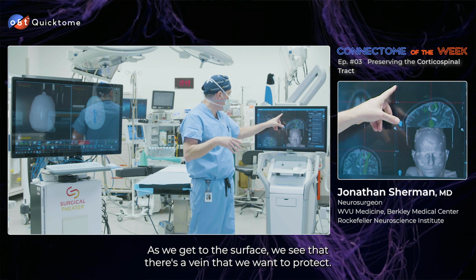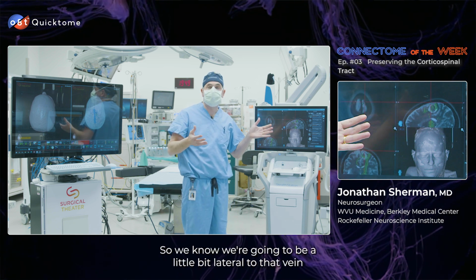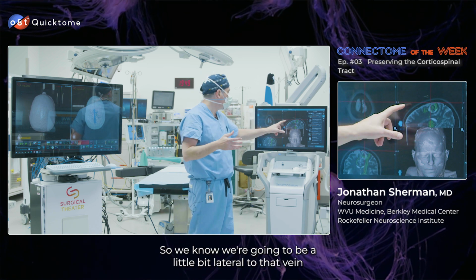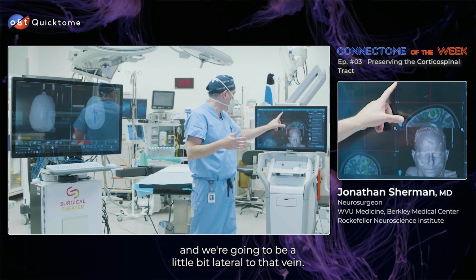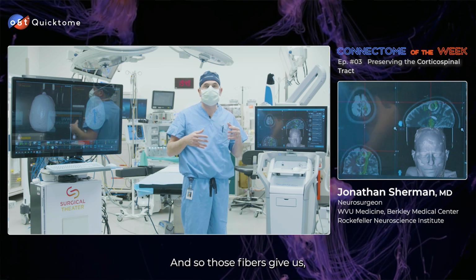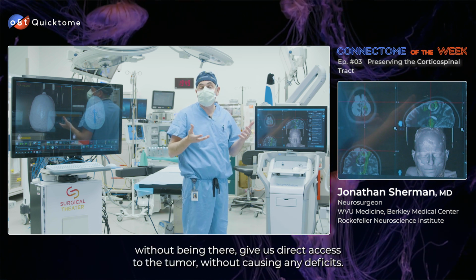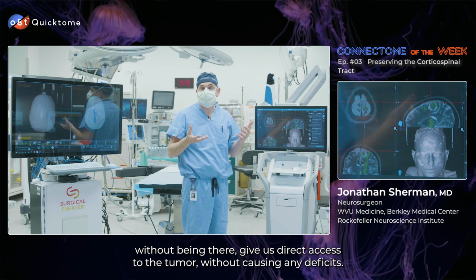As we get to the surface, we see that there's a vein that we want to protect. So that helps us out. So we know we're going to be a little bit lateral to that vein. And when we're a little bit lateral to that vein, we see no fibers. And so those fibers give us, without being there, direct access to the tumor without causing any deficits.